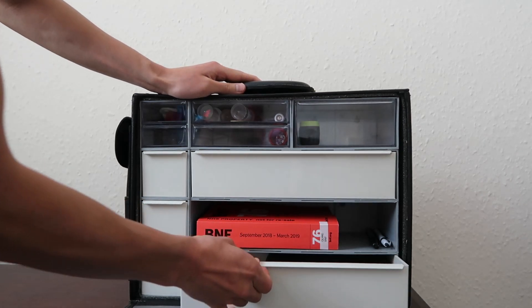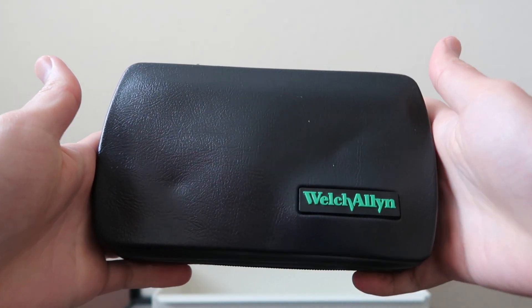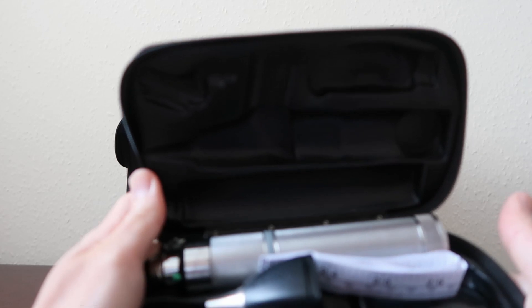In the bottom drawer I keep the ENT set — the otoscope and the ophthalmoscope. This is a Welch Allyn ENT set. It's advisable to get a good one that's reliable.